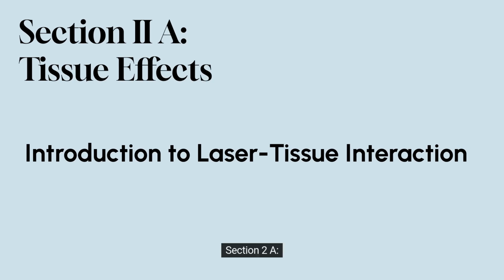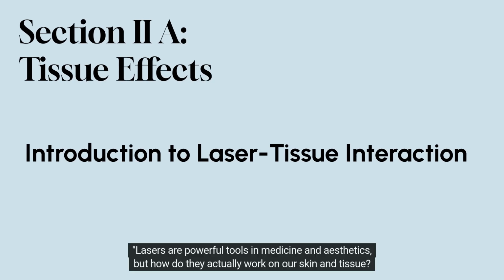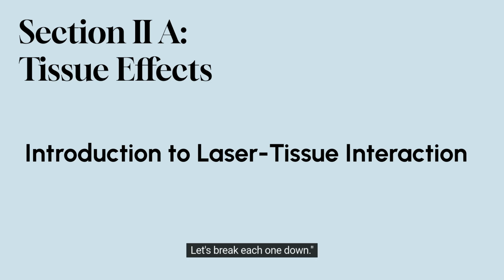Section 2A. Lasers are powerful tools in medicine and aesthetics, but how do they actually work on our skin and tissue? It all comes down to four main effects: photothermal, photoacoustic, photochemical, and photomechanical. Let's break each one down.